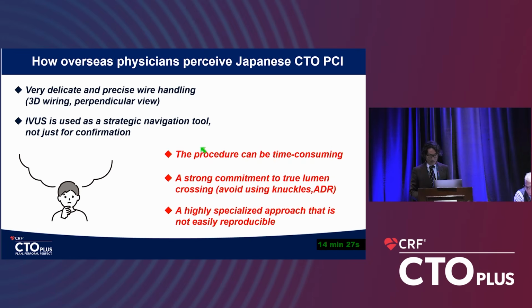However, on the other hand, I often hear that the procedure can be time-consuming, with too strong a commitment to lumen crossing and avoidance of knuckle wiring or ADR.